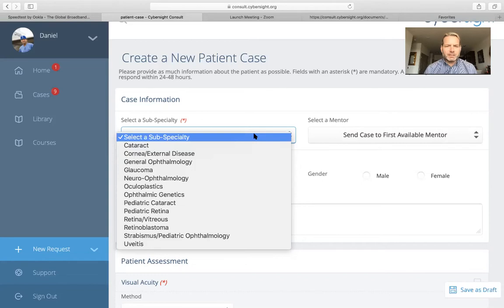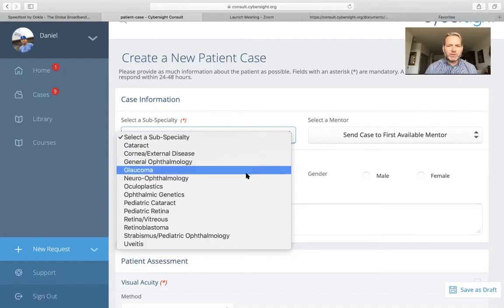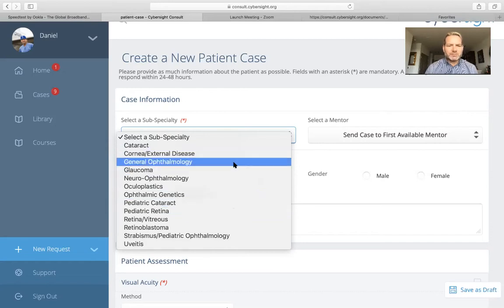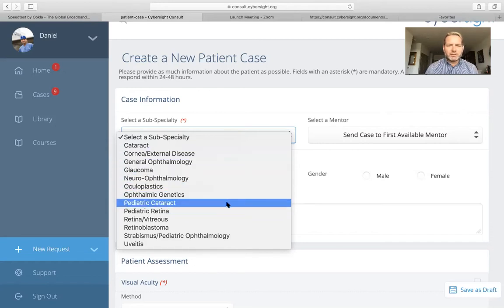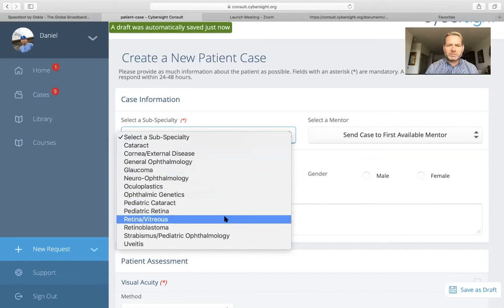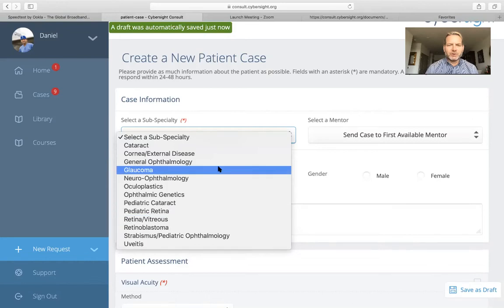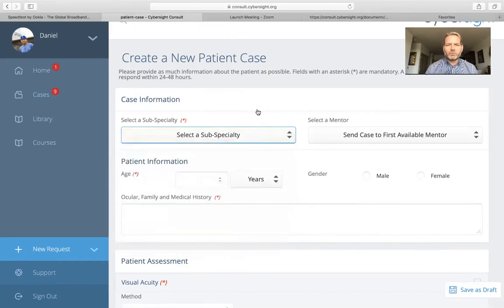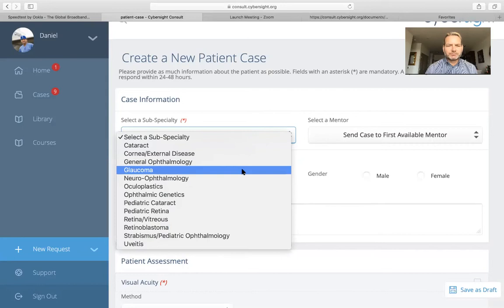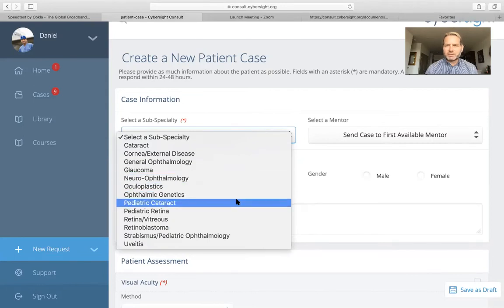Keep in mind that the AI software, which performs interpretation of fundus photos and optic disc photos, will only appear when you're under certain subspecialties. Currently, those three subspecialties are the categories of retina vitreous, pediatric retina, and glaucoma. Anytime you're in one of these subspecialties, the AI software interpretation option will appear.